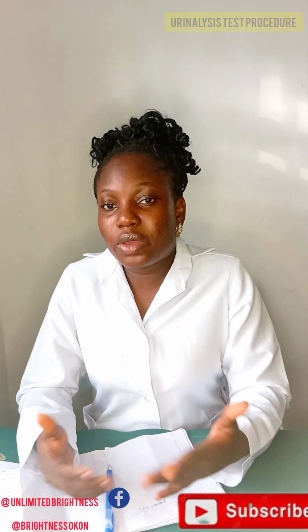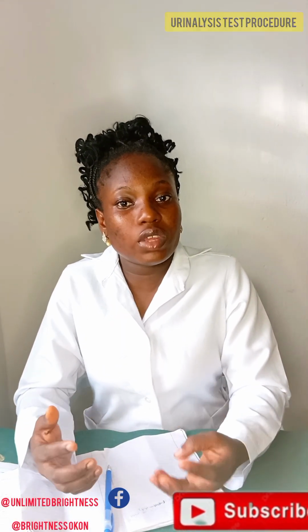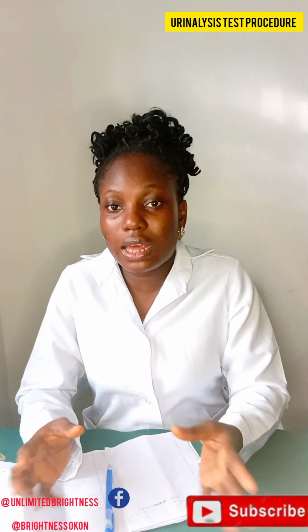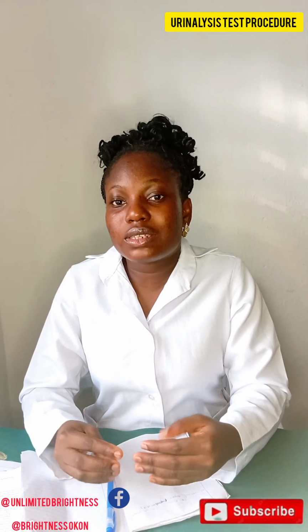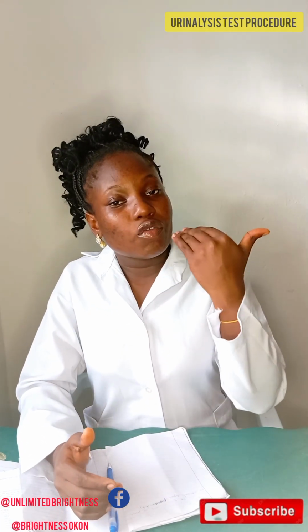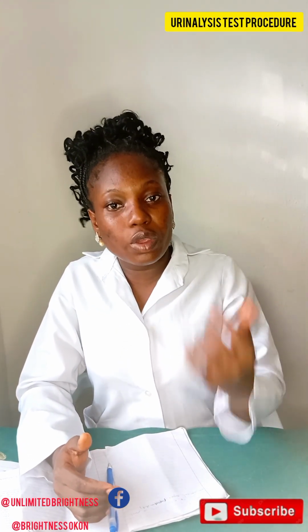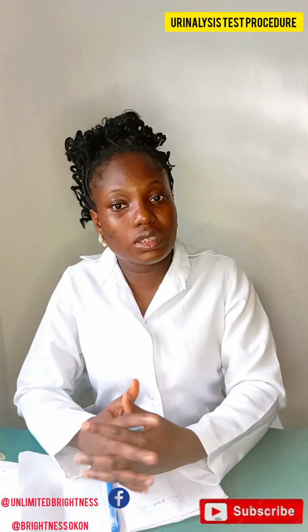Then we have the appearance. The normal urine of a healthy individual should be clear. Anything outside of being clear means that something is wrong somewhere. Your body is trying to raise an alarm that something is going on. You should do something about it. So this is the essence of this test.